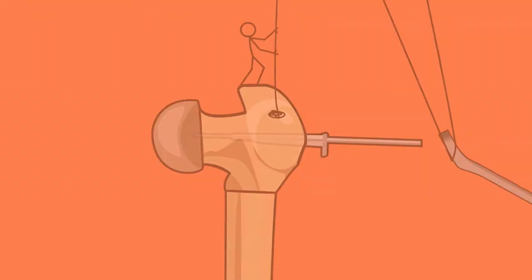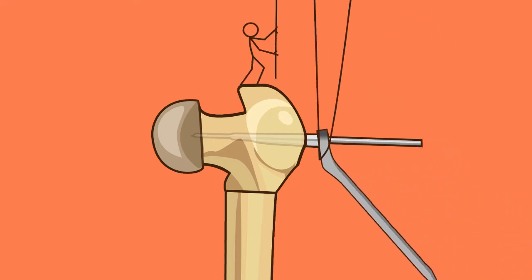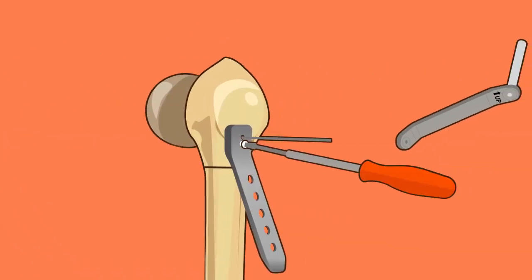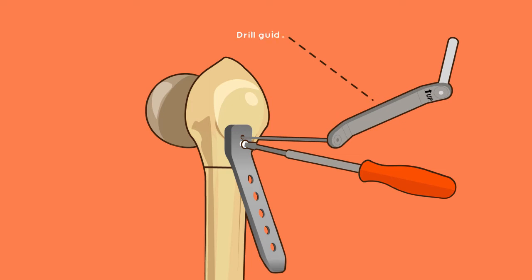Step 8: plate assembly. Insert the plate through the incision and hook onto the blade. Ensure full contact between the blade and the plate at the connection section. The drill guides can be used over the guide wire to push the plate against the blade for maximum contact and ease the threading of the connector screw in the next step.